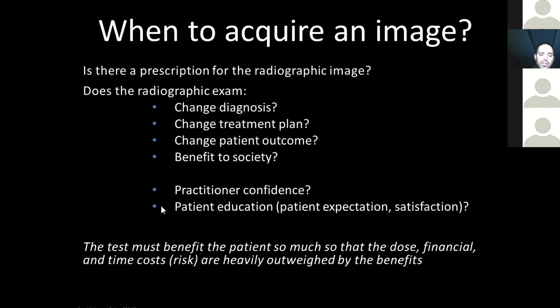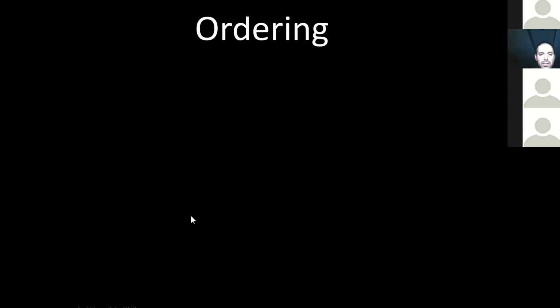I've also heard the perspective, well, I order the scan because it's an exceptional patient education tool. It truly is. You can explain a complicated scenario to a patient with that 3D data set. But that reason alone is not a reason to order the scan. You have to be, again, asking yourself here, will it change my treatment plan? So this is all kind of more on the philosophical end, and we'll be building on some of those choices and specifics next week a little bit.